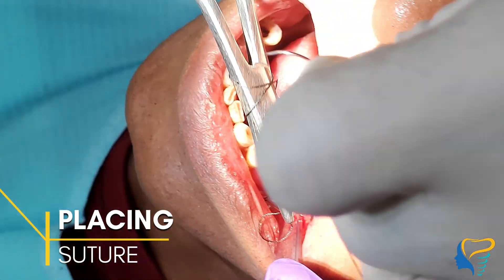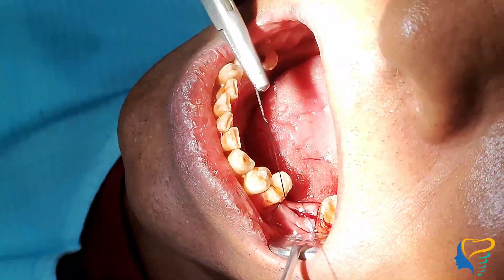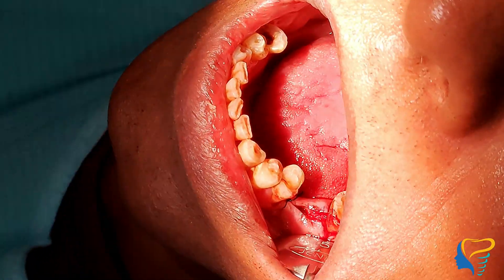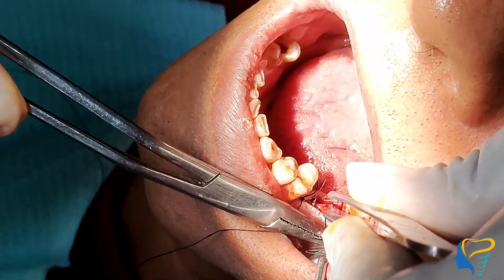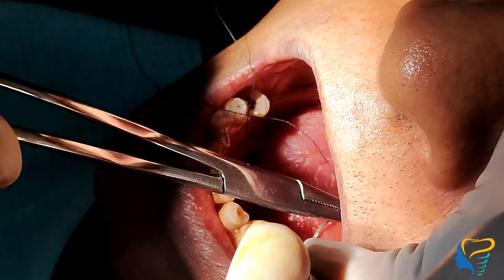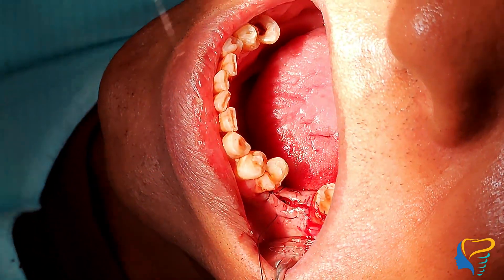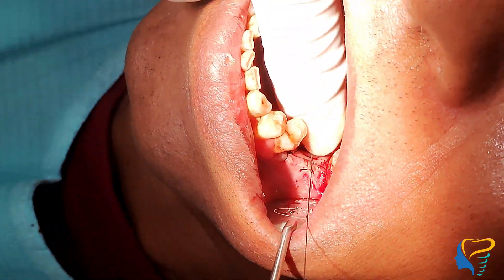Now comes the final step — suturing. The first suture I'm placing is a simple interrupted suture. For the second suture, if you observe closely, I'm placing a horizontal mattress suture so that the wound edges get everted, ensuring complete closure. You could also do two simple interrupted sutures instead.